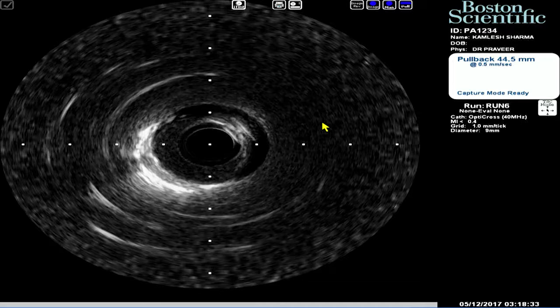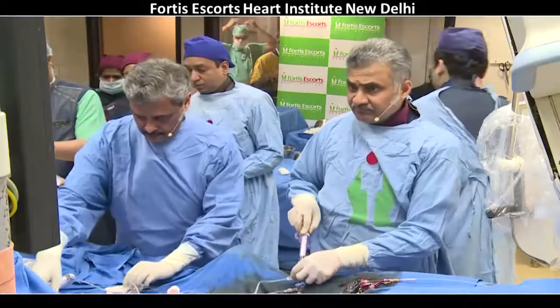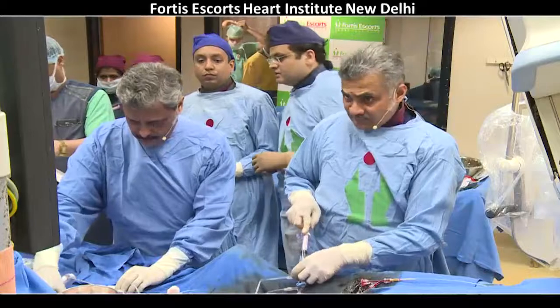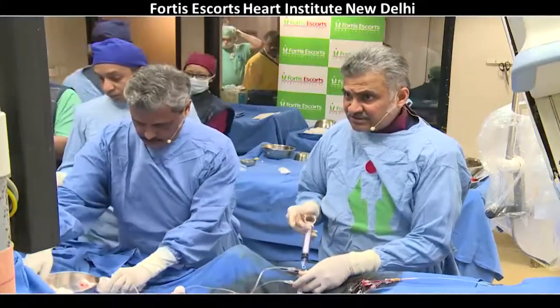So here, really getting high pressures is very important. I will go to 24, 26. The Quantum is very resilient. I'll take it now. I have not taken a mosaic up that high, but that's just because we're using the mosaic.